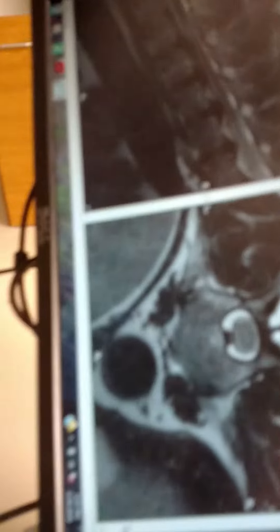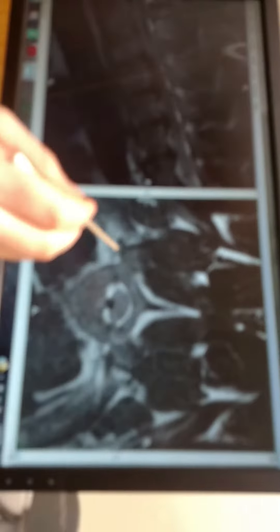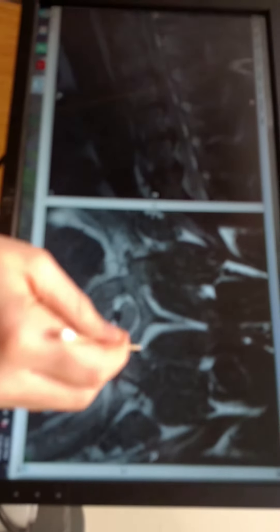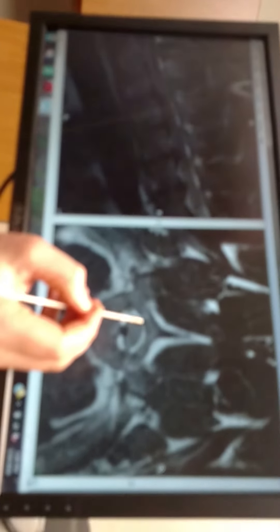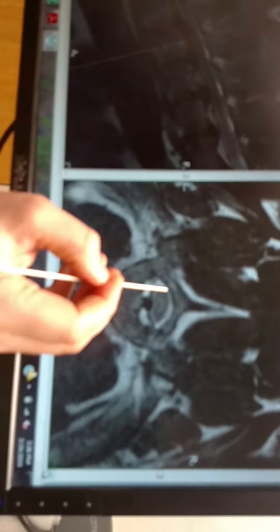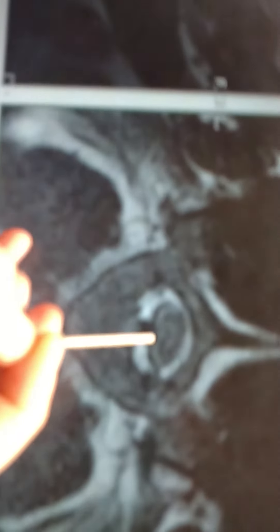Wow, that's so freaking cool. Top, bottom, left and right. This is a rib — see the rib over there. This is the bone itself, the vertebral column. Where is this in his body? Right here. This is the spinal cord with a ring of spinal fluid. This is fat. This is a little bit of disc protrusion.